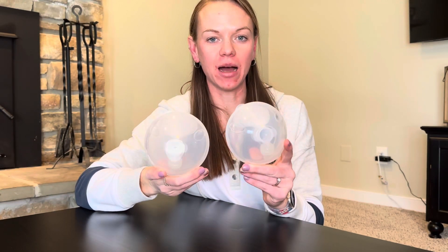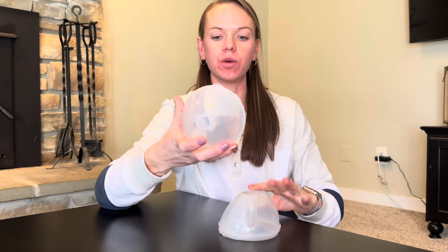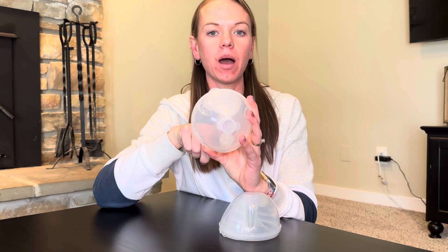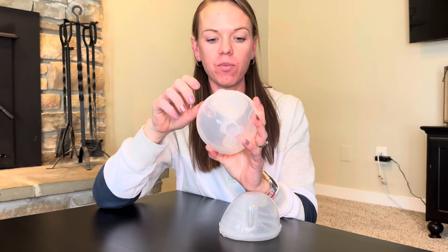Hi, let me tell you about these Free Me Cups. These are just the cups — the pump is not included. I just wanted to show you what they look like. These are the 25mm ones that I have out, but it comes with a 25mm and 28mm. So make sure you measure yourself.